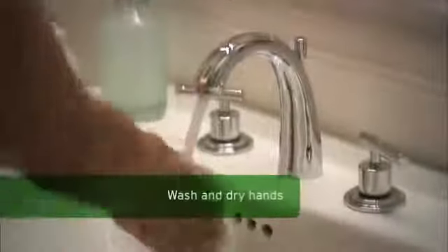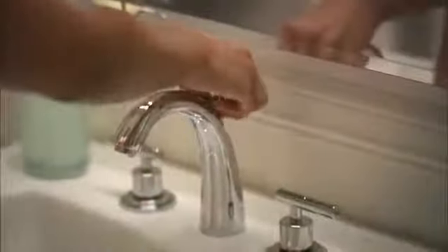First we'll cover applying your lenses. Thoroughly wash your hands with soap free of perfumes or moisturizers and dry them with a lint-free towel prior to handling your lenses. You'll also want to close the sink drain when you're finished washing your hands.